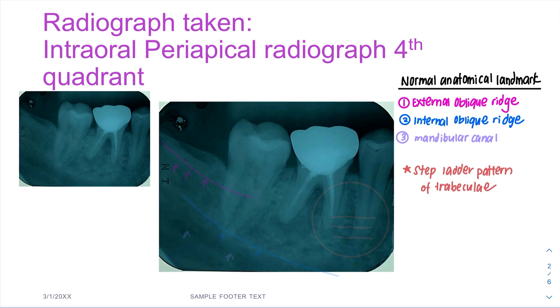Firstly, we interpret the normal anatomical landmarks. The first one is the external oblique ridge. This is a radiographic band which extends from the anterior border of the ramus downward and forward. Next is also a radiographic band which extends downward and forward, and this is known as the internal oblique ridge.